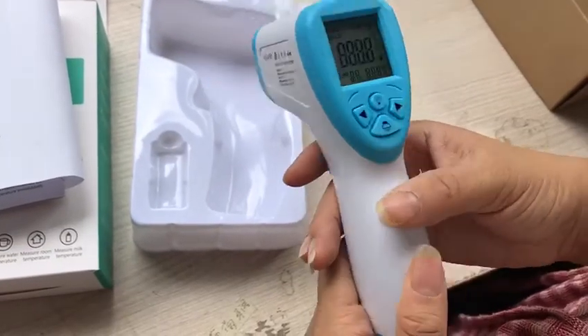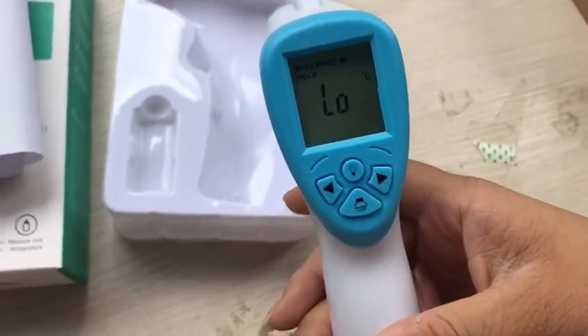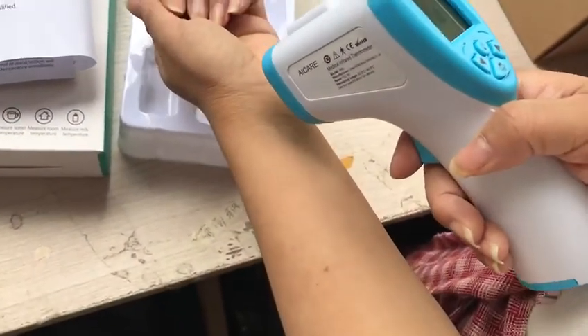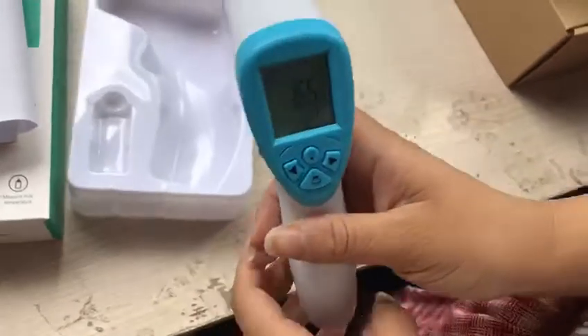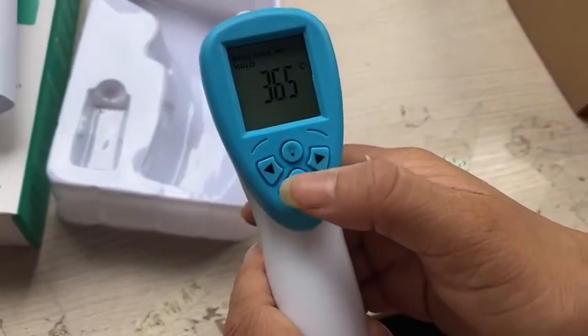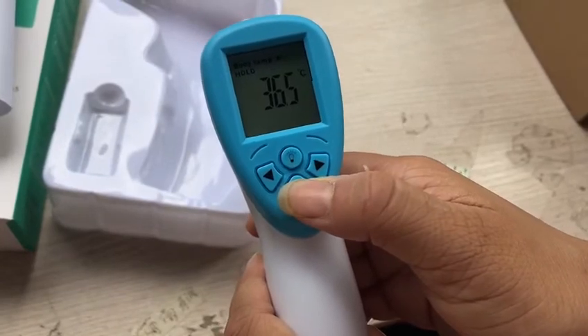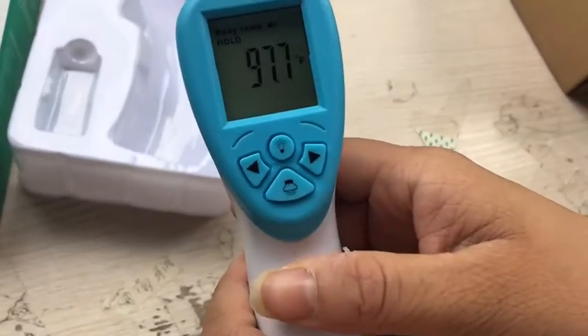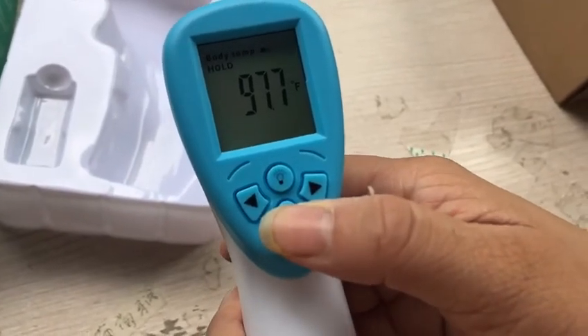Press this to start the machine. Here is the temperature, and now press this button. It's changed. Here is the temperature, and then press this button.